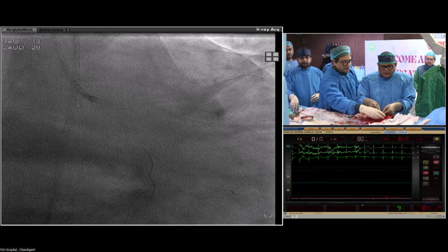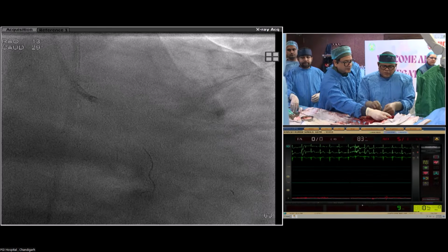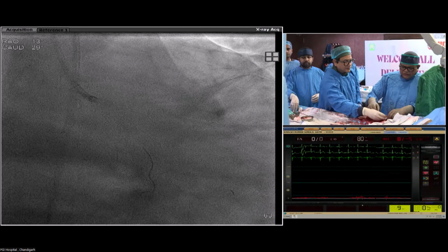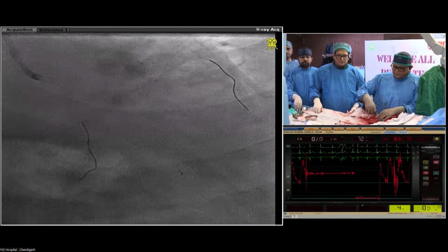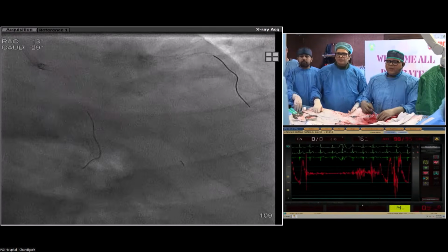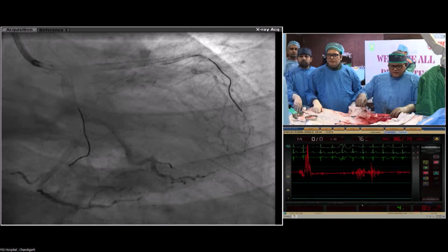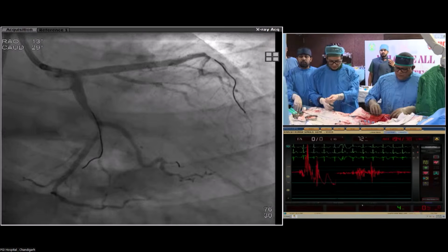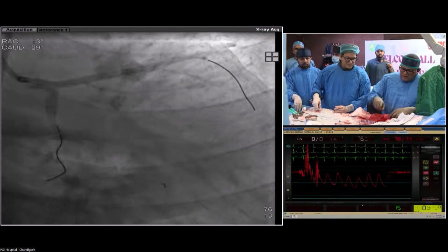Look now. If you can give us one shot, we'll have to go to the other lab. Okay, just hold. Let me show you. So this is what the result is, and let me go ahead. Yeah, it looks good. Final kissing followed by POT.